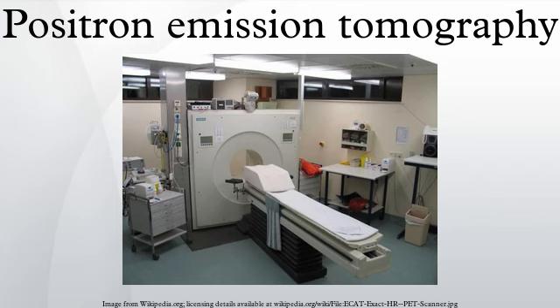In 1961, James Robertson and his associates at Brookhaven National Laboratory built the first single-plane PET scanner, nicknamed the head shrinker. One of the factors most responsible for the acceptance of positron imaging was the development of radiopharmaceuticals. In particular, the development of labeled 2-fluorodeoxy-D-glucose by the Brookhaven group under the direction of Al Wolf and Joanna Fowler was a major factor in expanding the scope of PET imaging.